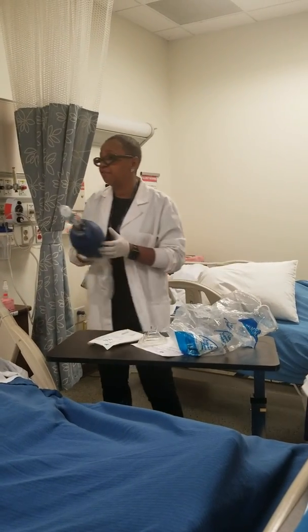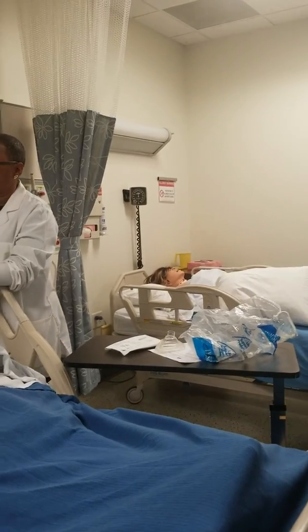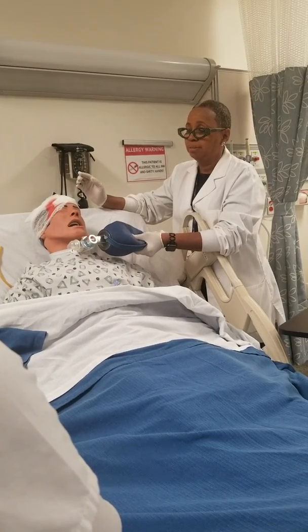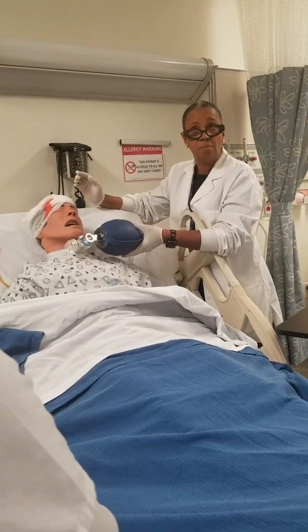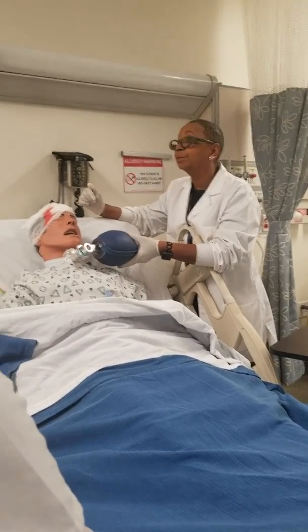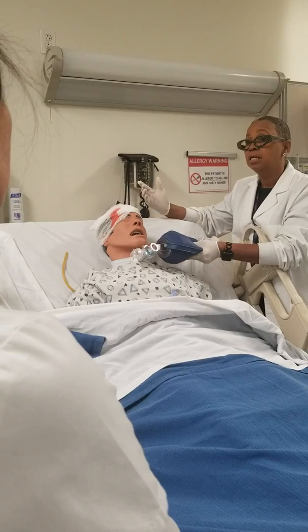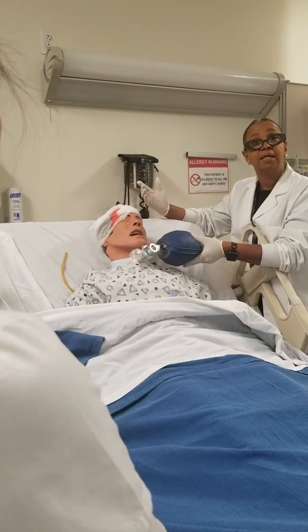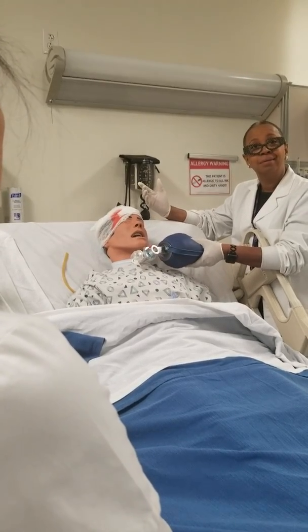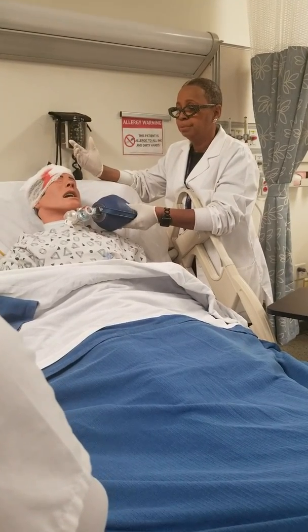If they hyperoxygenate him for 30 seconds, this just tells you how much the patient can tolerate. This gives him a better chance at surviving while you don't have any oxygen. Here's the deal, he's got what in his lung? Fluids. So what am I trying to do? I'm trying to give him some oxygen that will let him sustain his airway until I can suction him out, right? So what am I bagging against? Fluid, and pushing it out. But I'm still trying to get gas exchange.